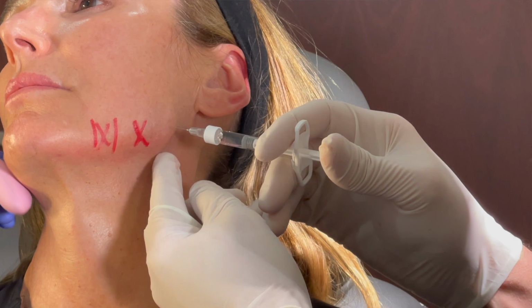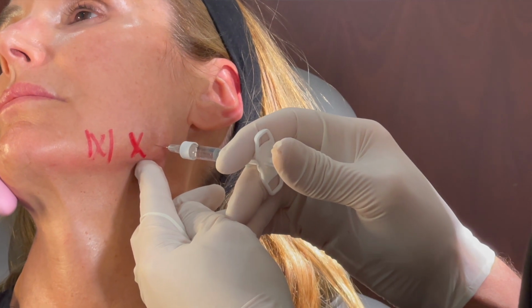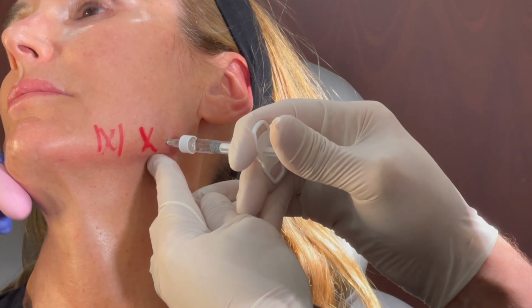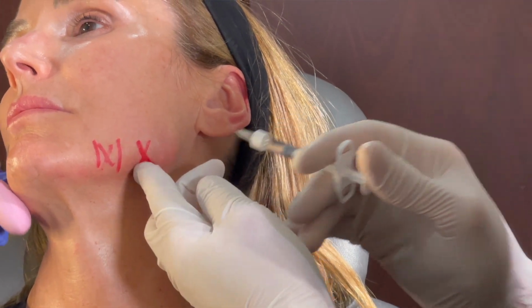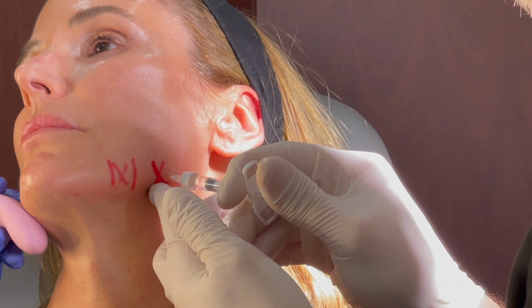Okay, and now I'm going to go a little bit anterior to that, approximately 5 millimeters above the mandibular border, and go down through the masseter onto the periosteum again, with between 0.1 and 0.15 injection. Now I'm going to double check where the antegonial notch is, and inject one more time down to the periosteum through the masseter.